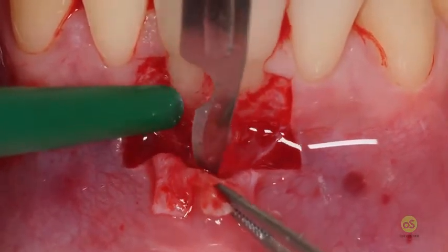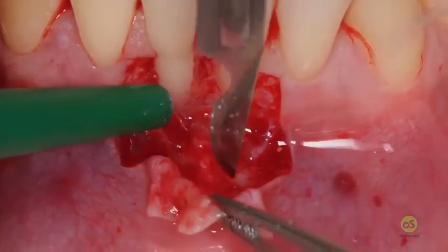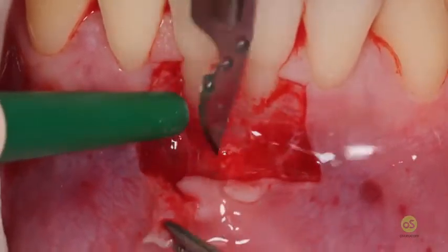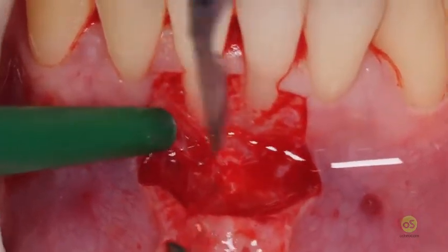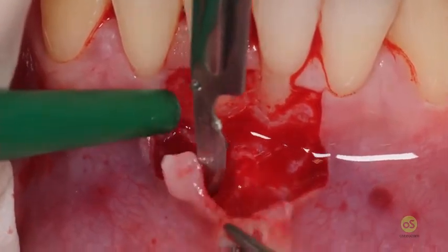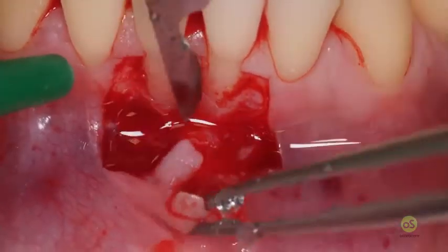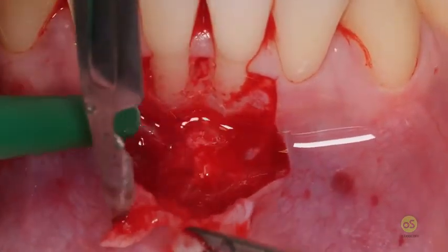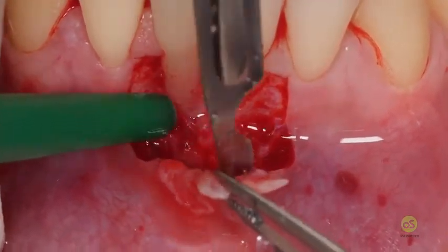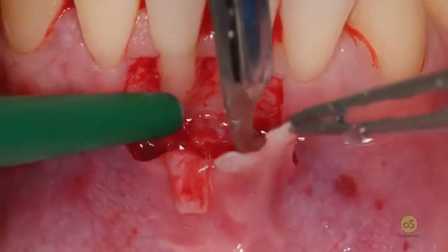And you will gain this flap by removing the whole muscles in your flap, only using the tip but going with your flap parallel to the lining mucosa of the lip. And your safe area is only the area of the papilla, right? I pull the lip, remove the muscles, check the movement of the flap from inside.